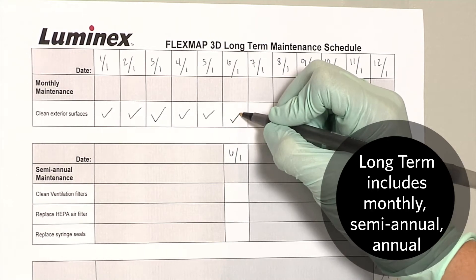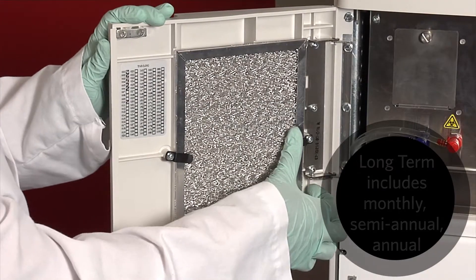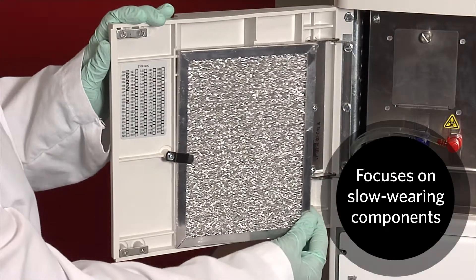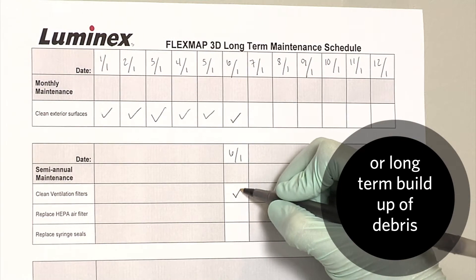The long-term schedule includes monthly, semi-annual, and annual maintenance procedures. These procedures focus on components that wear slowly, like seals, or have long-term buildup of debris, such as a filter.